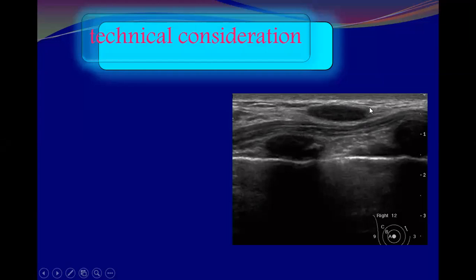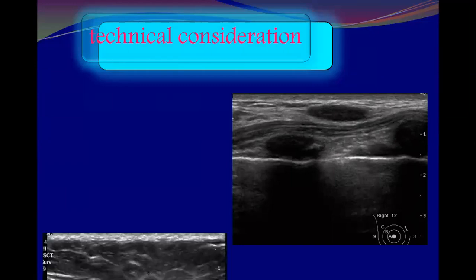Very thin breast tissue, but this is a fibroadenoma in the thinnest part of the breast, in its extreme medial superior part, where the breast is fixed and thin. While these are seen behind the muscles, representing pseudo lesions.